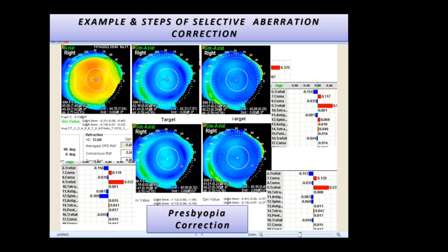But if you look at the other picture, here it is 42. So this means I corrected only 2.5 diopters. I left the patient with minus 1.5 myopia here. You may say, okay, you made it monovision, right? One plano and one minus 1.5. You may think this is monovision. Not really like that. If you look carefully at the Q value down here, small letters, it was minus 0.15. And if I'm going to treat for distance, I don't really change it.